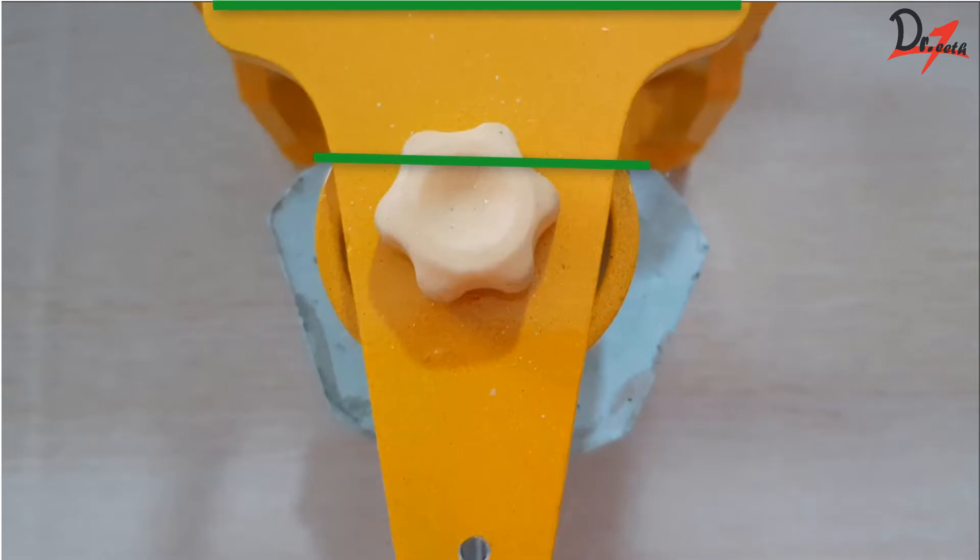Checking this is very important or sometimes we tend to rotate the cast on one side. So, this will create problem in teeth setting. So, make sure you check from the superior surface also.